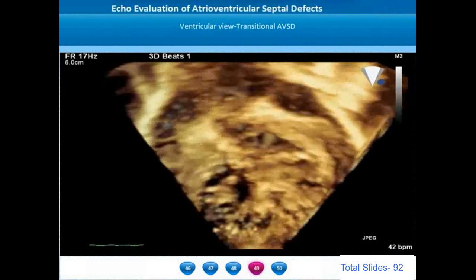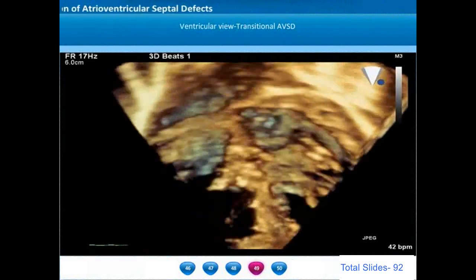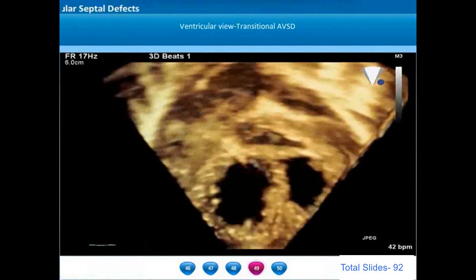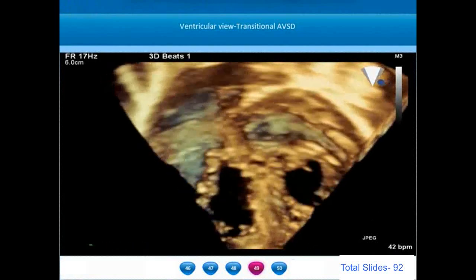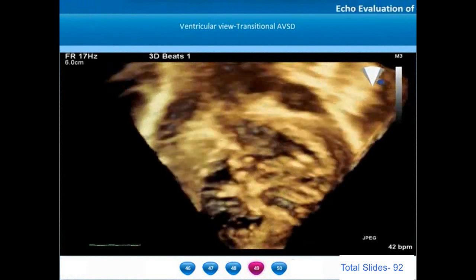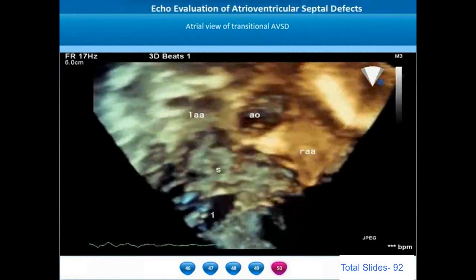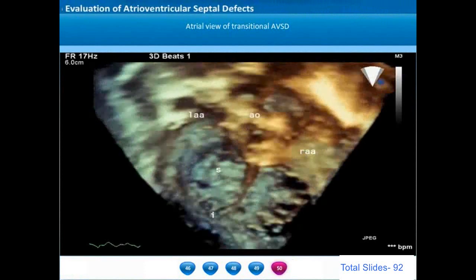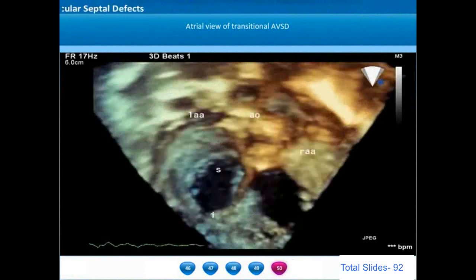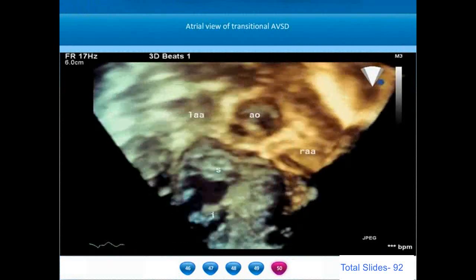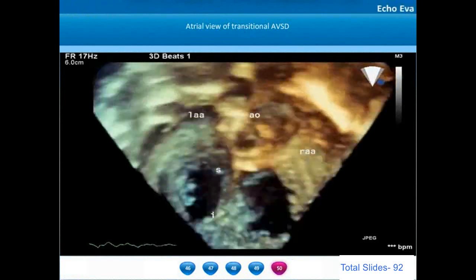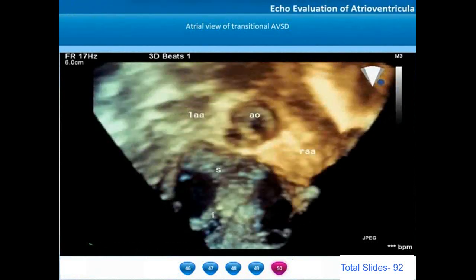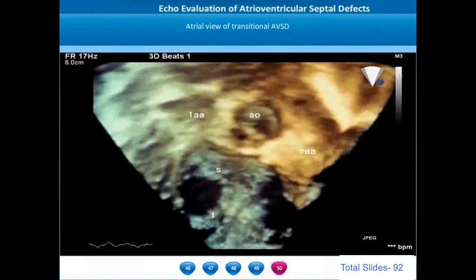In isolated cleft of anterior mitral leaflet, the cleft is directed towards the left ventricular outflow tract and aortic valve rather than the interventricular septum. The left ventricular outflow tract is appreciated anterior to the AV valve annulus. The atrial en-face view on 3D echo shows the left-sided AV valve formed by the zone of opposition between the superior and inferior bridging leaflets, with dilated left and right atrial appendages visible.